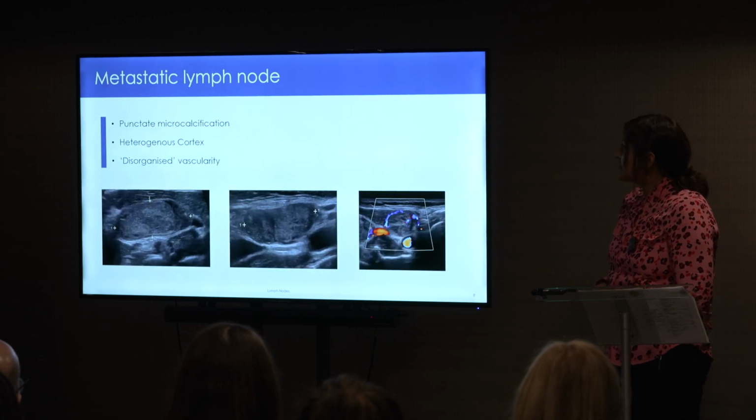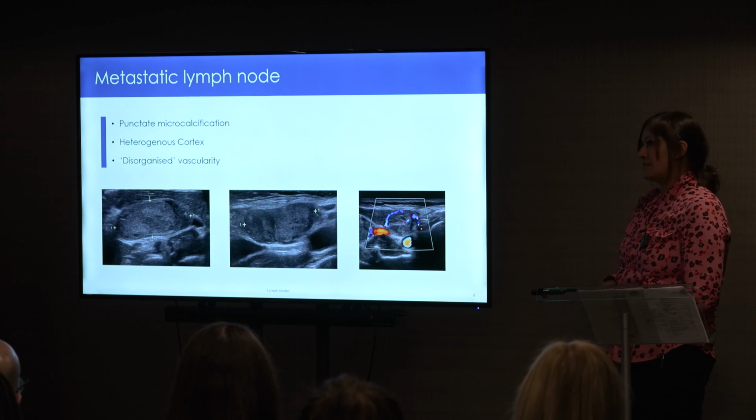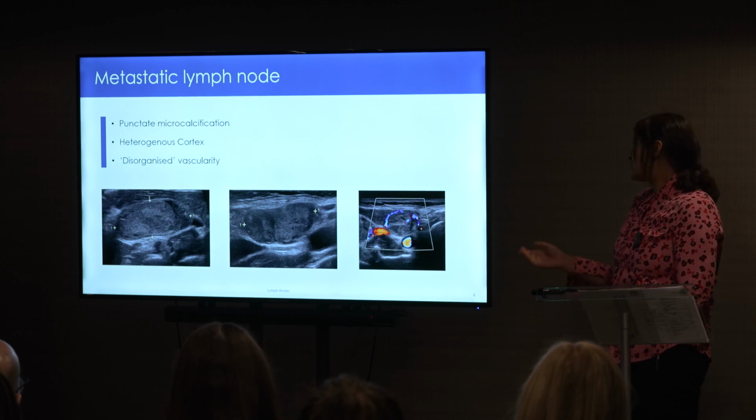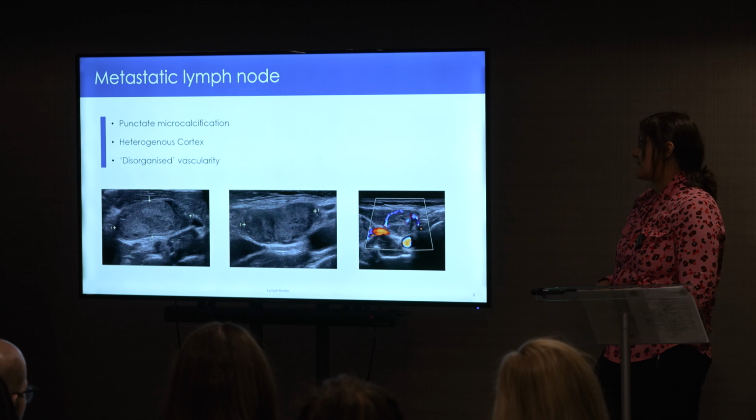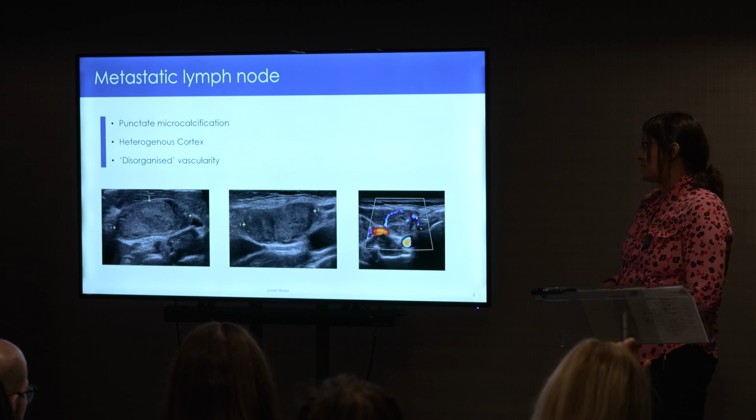So my first example is an example of metastatic papillary thyroid carcinoma. These presented as obvious palpable lumps in the patient's neck. Unfortunately, she waited a few months before it presented, and these were present throughout levels 2 to 4. And sure enough, I found the culprit, a U5 nodule in the thyroid gland.